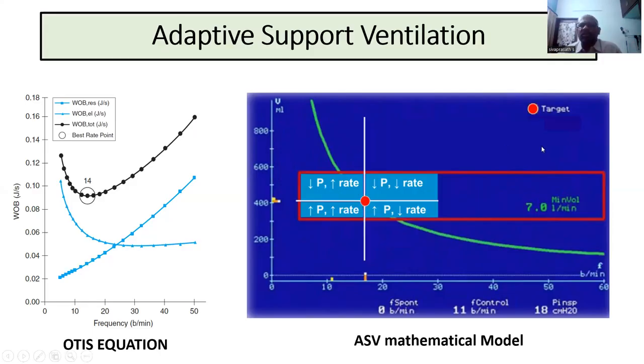And it will also have a square. This rate and pressure cannot go out of it. These are called runaway parameters. It will fence that rate and pressure within the physiological values. It will not allow it to go away or run away parameters.